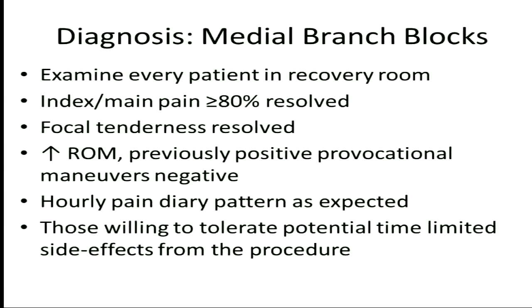For the diagnosis, we examine every patient post-procedurally, looking for 80% resolution of the pain. It can sometimes be difficult for the patient to describe that topographical numbness and whether it really correlates into pain relief for them. But if you take the time to examine the patient, you see that their range of motion is improved, which is typically their most painful maneuver, or have them walk or do some of the other provocative things.